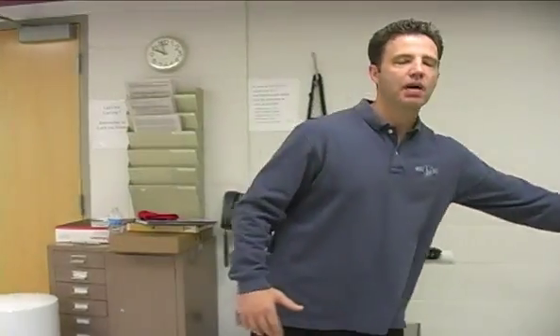And again, it's based on those two compartments of fat mass and fat-free mass. So if you were using a different modality, let's say skin-fold calipers, with the Nelson formula, it wouldn't be as accurate because the body composition portion isn't accurate. So it's another value to add. It's quick. You don't have to fast like you do with indirect calorimetry. It's another value to add if you're providing information for the community or, let's say, an athletic team.